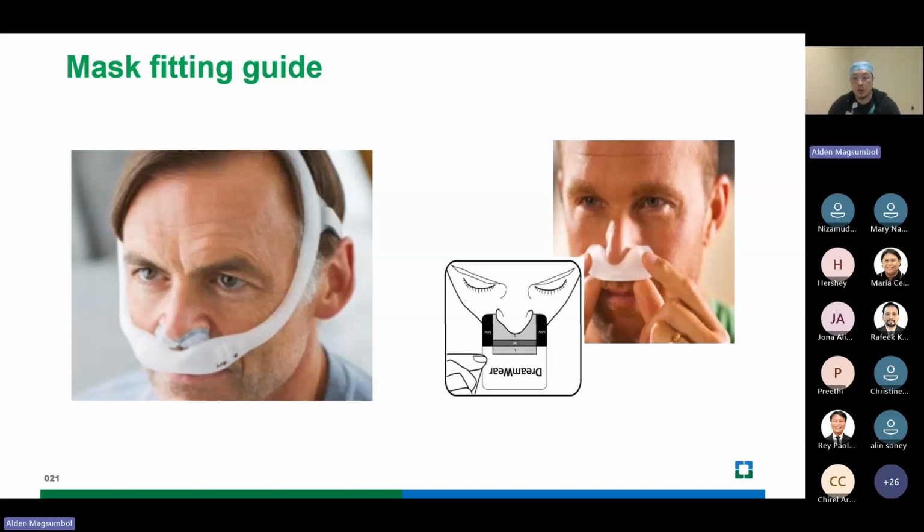If you are using a gel type pillow sizing gauge, place the pillow cushion on the tips of the nostrils, and then choose the cushion size that allows the blue gel bases to sit comfortably under the nose without any gaps. It's also encouraged to try multiple cushions to find the right size that allows your patient to breathe easily, as it has more comfort to fit.